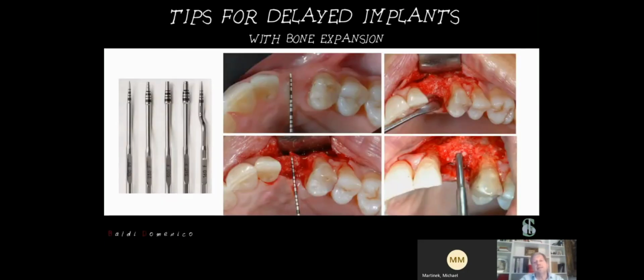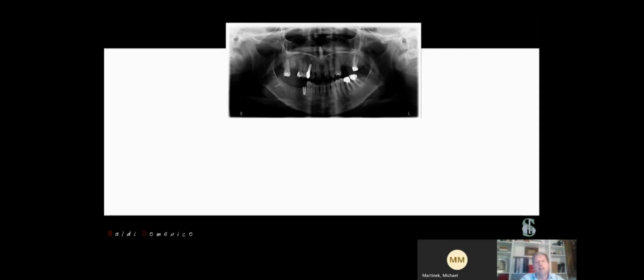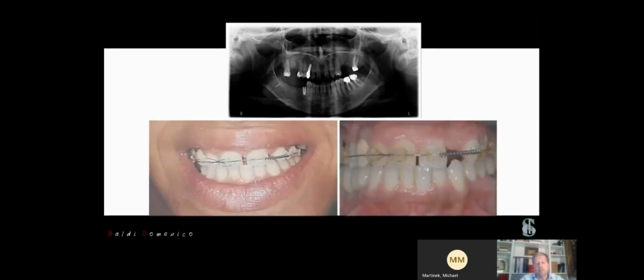Sometimes it is necessary to make an expansion of the bone during our preparation, especially when we have a resorption of the bone. And again, in this case, I want to show you how it is possible to make a good implant site preparation. Look at here. Here you will see two different kinds of approach.